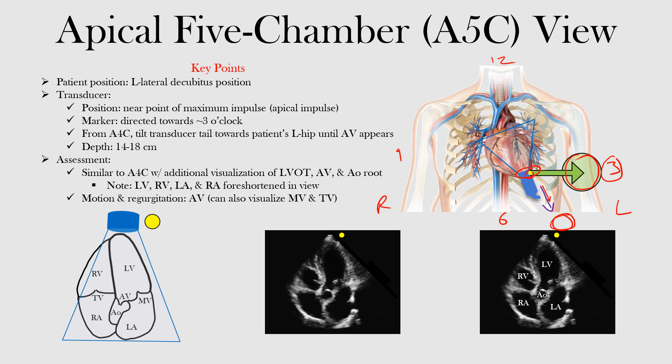So what do we see in this view? We have three different depictions: a cartoon depiction on the left side, an unlabeled image in the middle, and a labeled image on the right. Notice that we brought the aortic valve into place — it's sitting in the center. Here's the aorta, and then you have the valve. You're seeing the left ventricular outflow tract, the LVOT, the aortic valve, and the aortic root. That fifth chamber is essentially the aorta — the valve, the root, and the outflow tract. You can also see the left atrium, the right atrium, the left ventricle, and right ventricle.